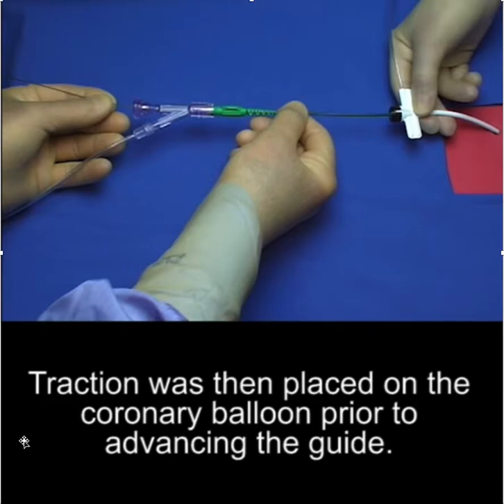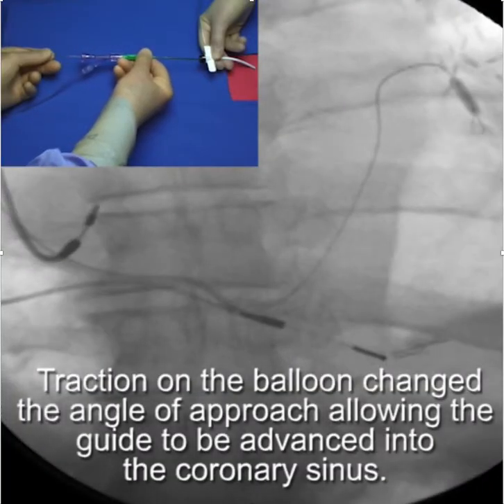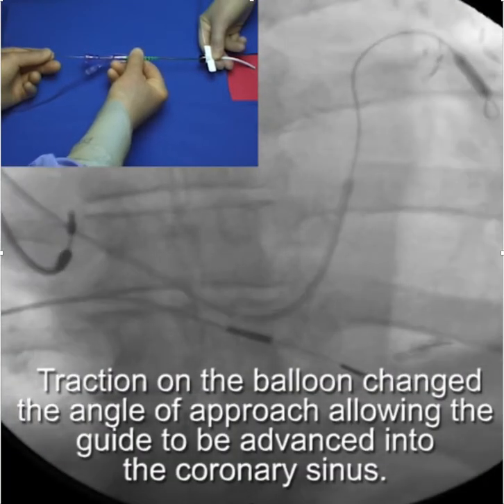By applying traction on the balloon and then advancing the guiding catheter, I was able to advance into the coronary sinus.